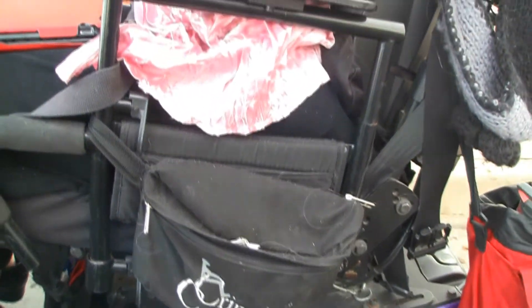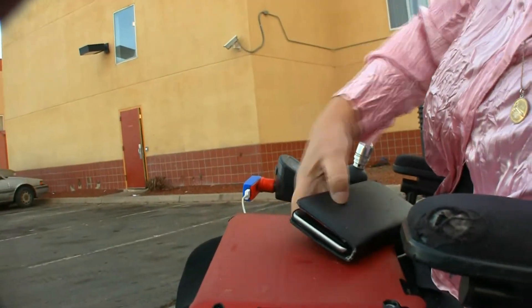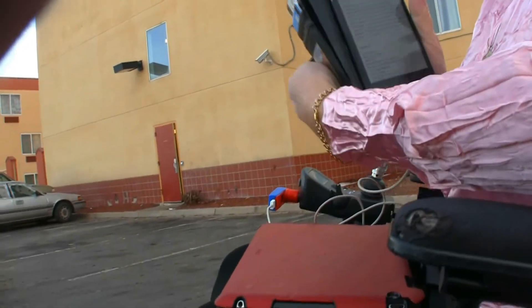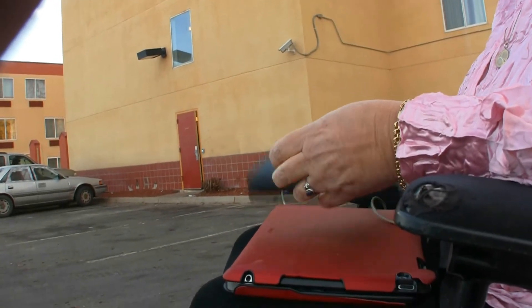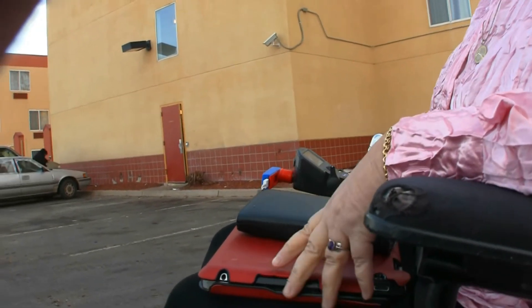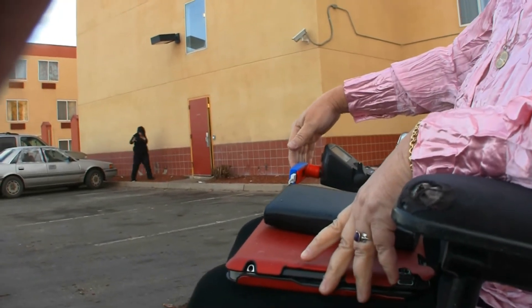Julie also has one of our side bags on the side of her chair, and of course one of the shiny knobs over on her joystick, so she's all decked out. Julie's been the tester of most of the USB variations for the last couple of years, and she has the one and only service charger. So that's the USB charger in action.